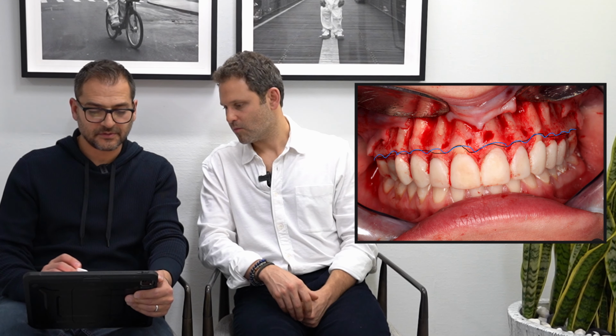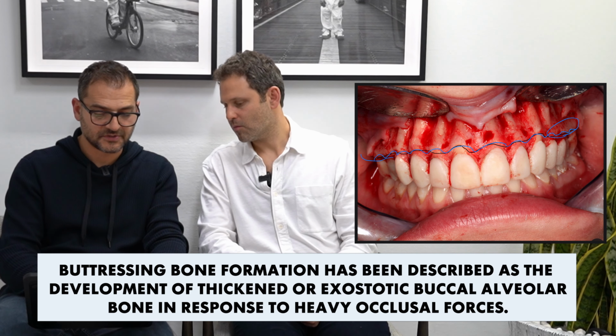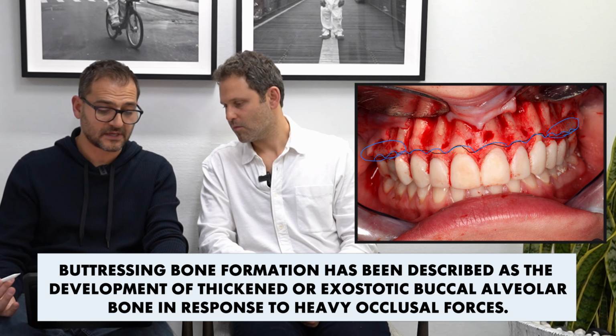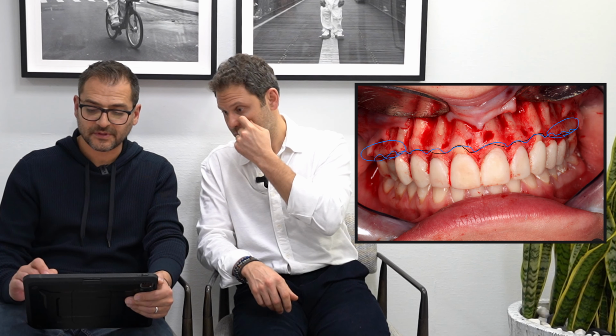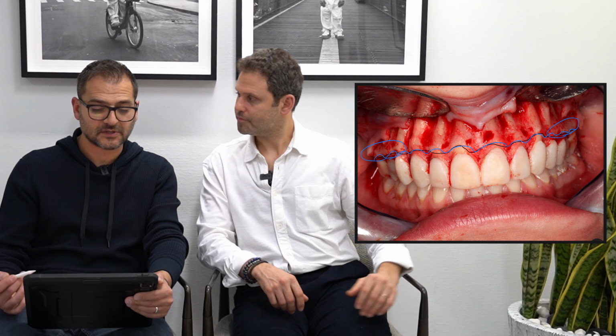The other thing that we do in this case is address what we call buttressing bone, which you can see here on this left and right side. And what that basically means is there's a lot of extra bone. It's also termed an exostosis. What we're going to do with this extra bone is shave it down, trim it down, but make it still look natural once it's been removed.